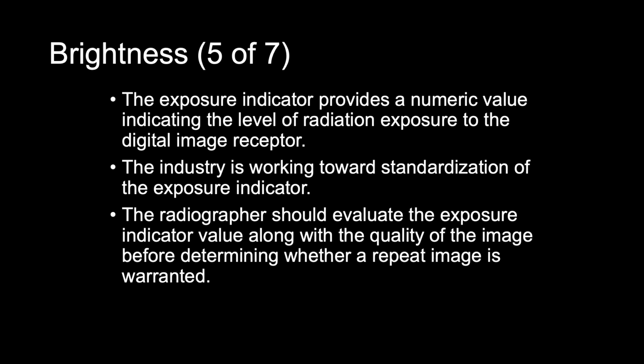The EI, or exposure indicator, provides a numeric value indicating the level of radiation exposure to the digital image receptor. The industry is working towards standardization of the exposure indicator. The radiographer should evaluate the EI value along with the quality of the image before determining whether a repeat image is warranted.